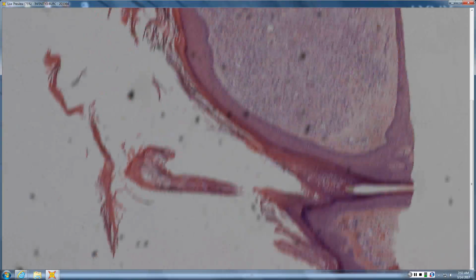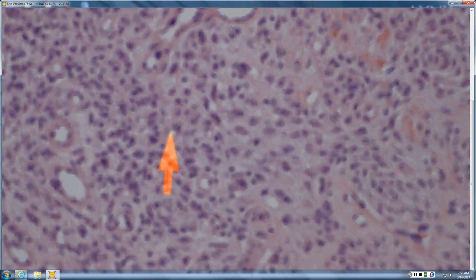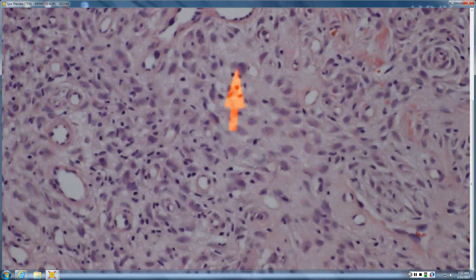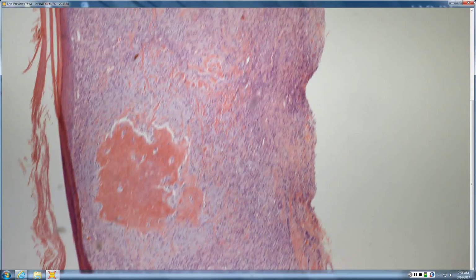So go back to some of the basics. It's a fibrous tumor. The overlying epidermis is A, thinned and atrophic, or B, acanthotic. Do you know any fibrous tumors that cause acanthosis? DF does. So your first question then is, is this some kind of weird variant of DF? Do you know any variant of DF where your cells, instead of being spindled, are epithelioid or triangular, pyramid-shaped? Like an epithelioid histiocytoma.